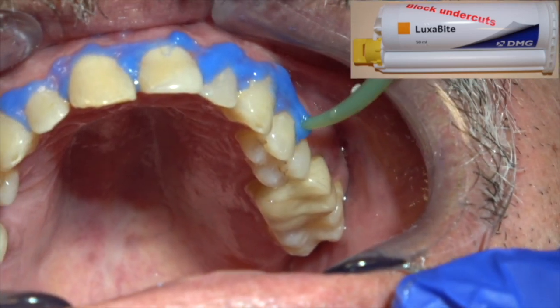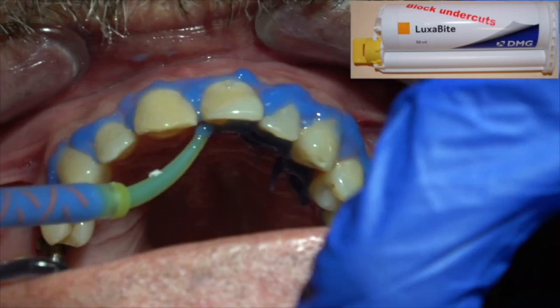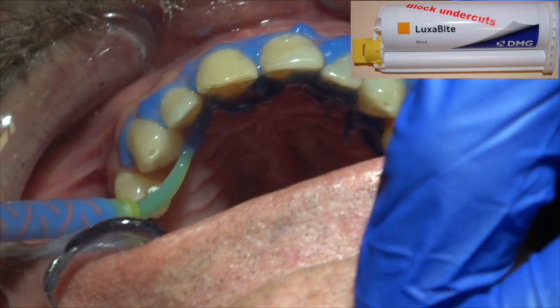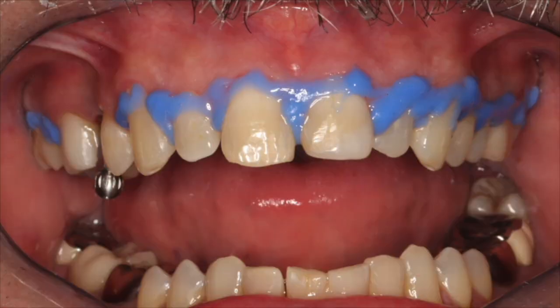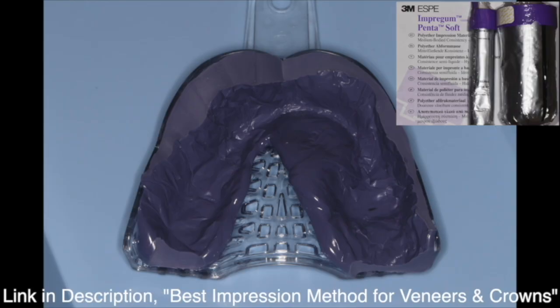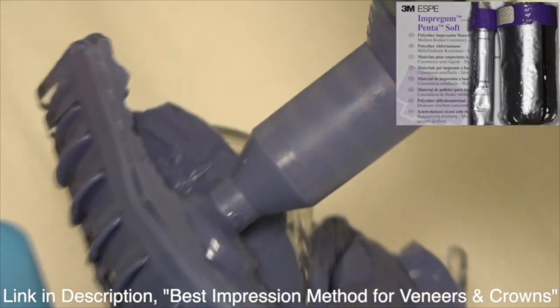We're going to put this block-out material around the other teeth because I'm going to take a polyether with custom tray impression — it's real rigid and it can lock into those undercuts and be difficult to remove. Watch the video on impression taking with polyether with custom tray.